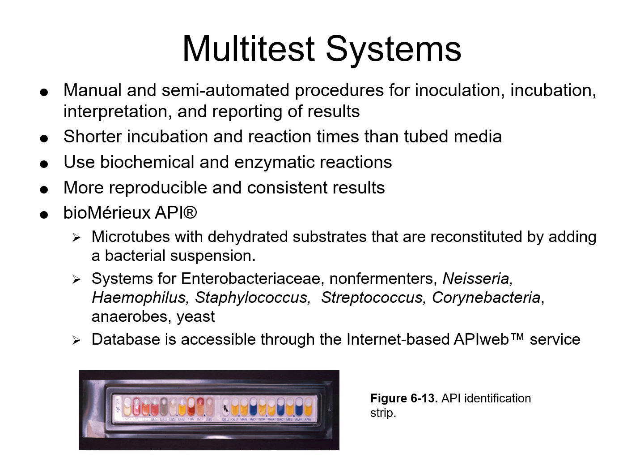You put a certain amount of bacteria in, and you're looking for a particular cloudiness or turbidity in that solution to determine if you have enough of that organism present. Then you place that suspension into each of the wells located here. Each of these has its own little well, so each is an individual test. These here are various carbohydrates, some of those we talked about. Once you make that suspension, you put it in here, and depending on the test, you might have other steps involved.